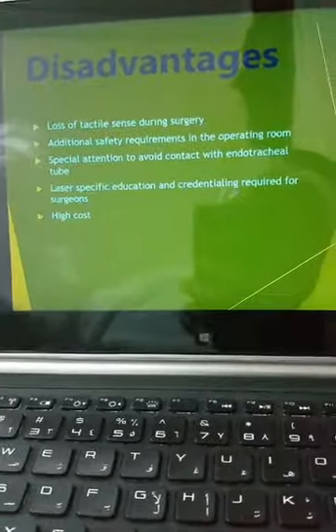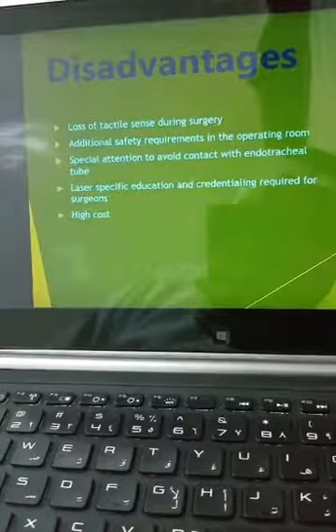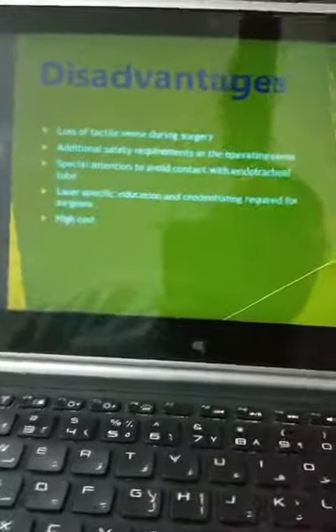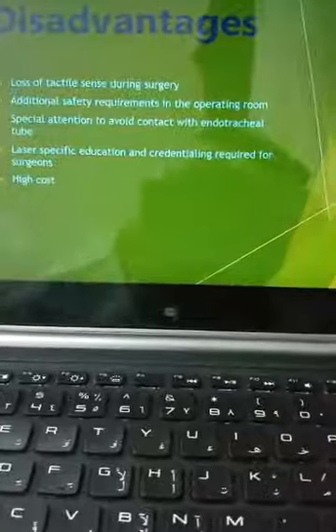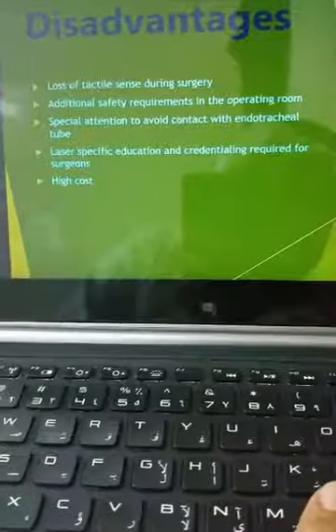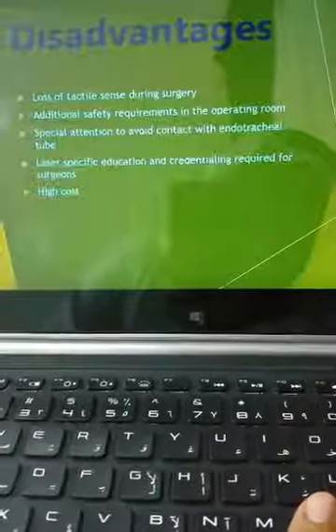I have to switch on the machine and plug it in, and then I might ask for another machine to plug in. I hope in the future we will have one machine that gives me all types of wavelengths, with just one button, like what I have there. Maybe it has Nd:YAG, but it doesn't have a diode or CO2. So we are still looking for the day that we can buy one very cheap machine that can give me all types of wavelengths.